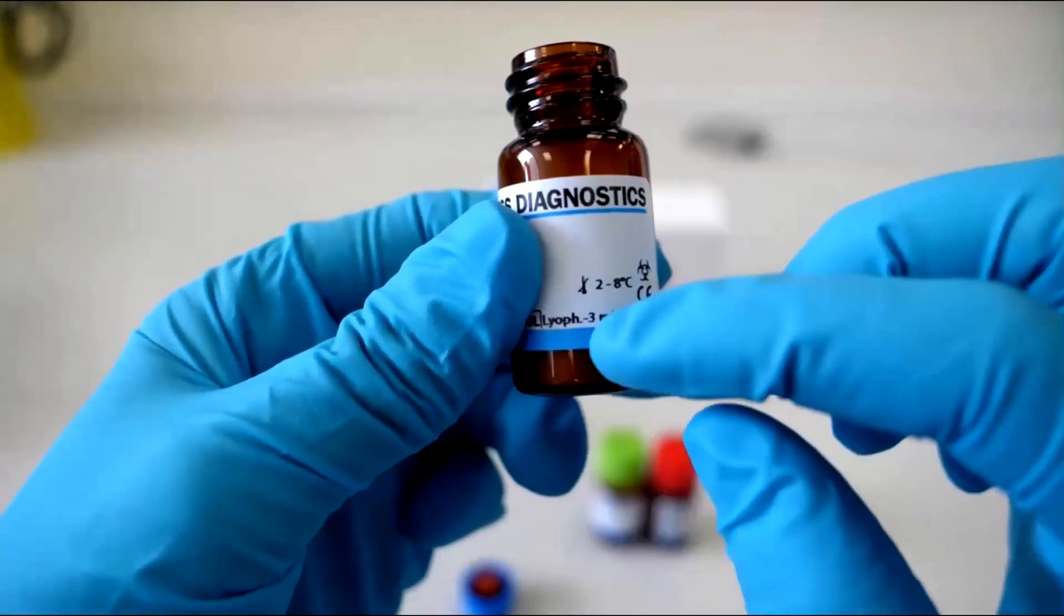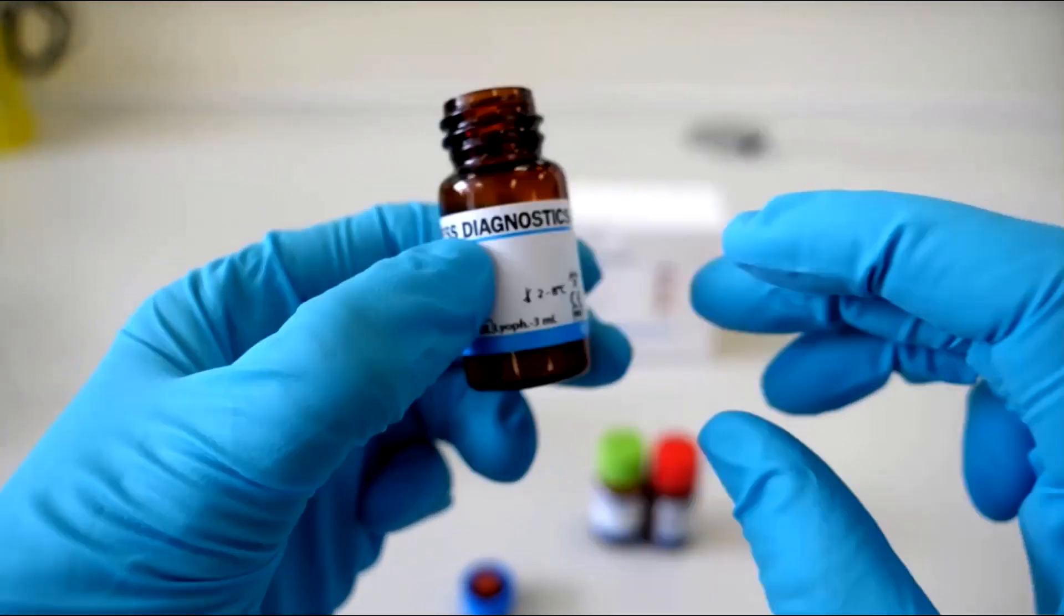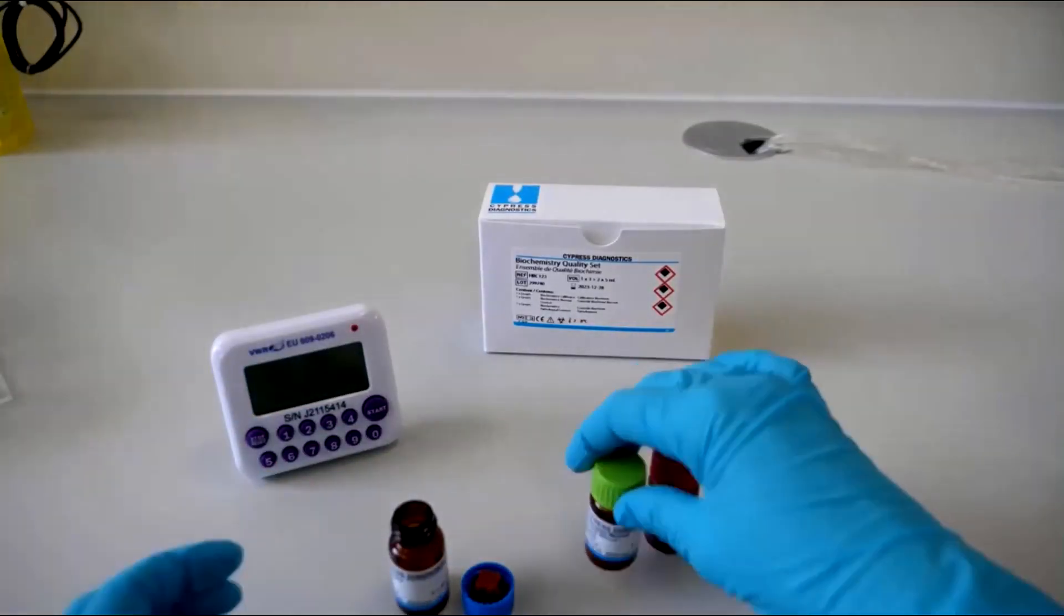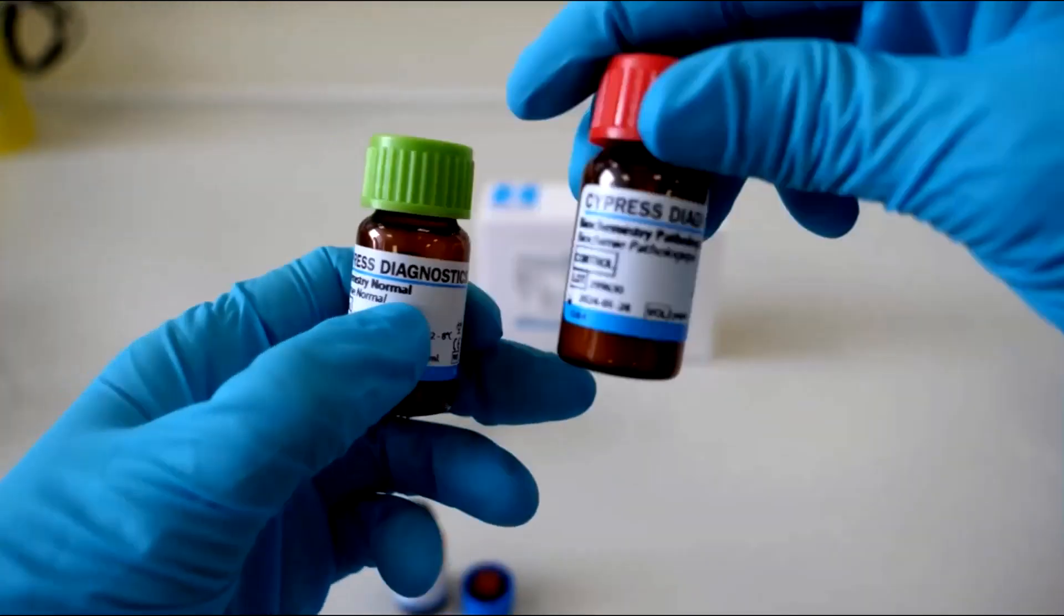The label on the vial indicates the amount of distilled water to add. 3 milliliters for the calibrator and 5 milliliters for each of the quality controls.